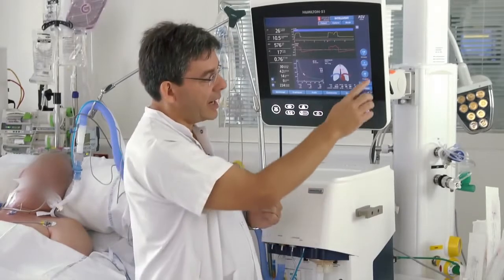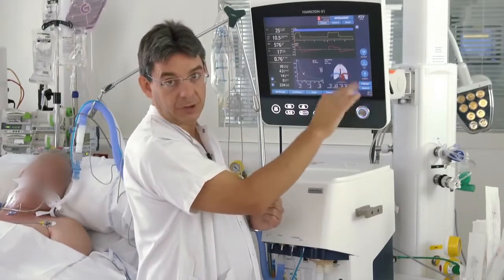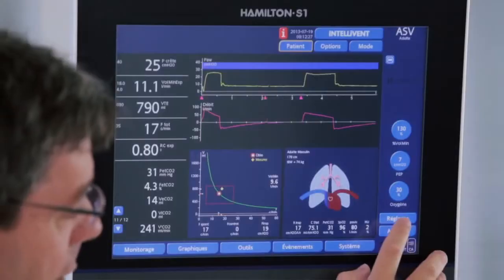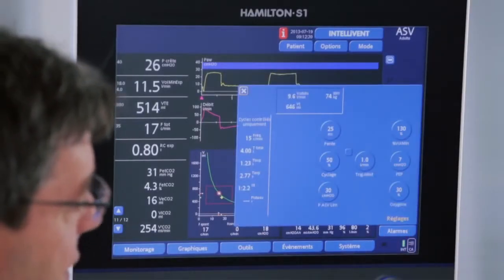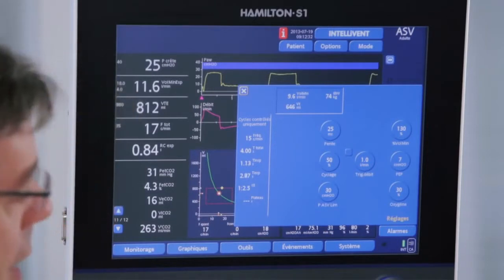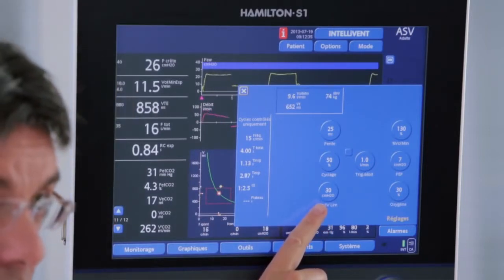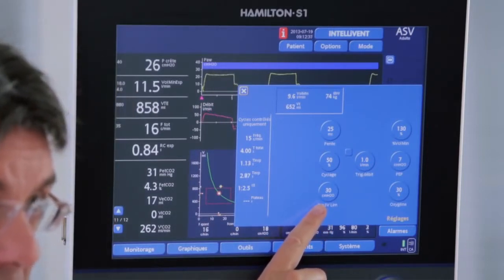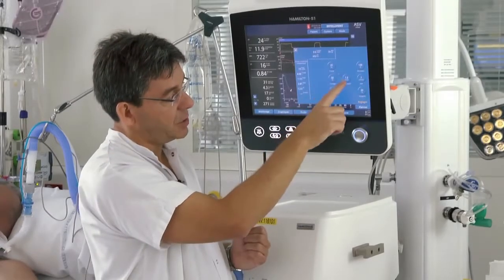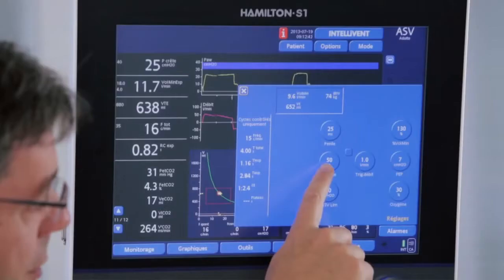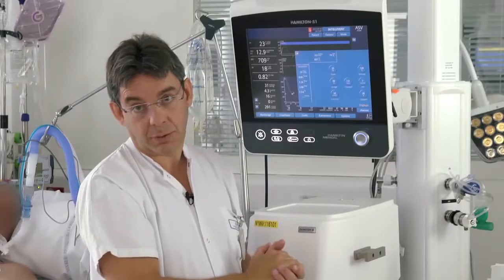In ASV, the oxygenation parameters — PEEP and FiO2 — are manually set. In the settings we also have to set the maximum pressure limit, the inspiratory trigger, expiratory trigger, and pressure ramp.